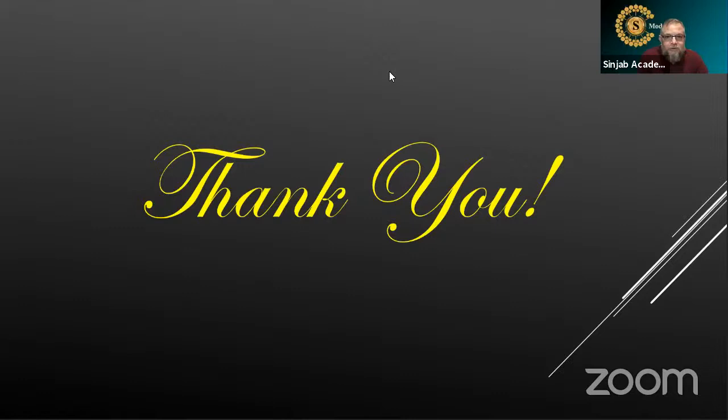Thank you very much, Dr. Gdih. Actually, that's wonderful. This is the first time I understand interpretation of visual field. Believe me, this is the first time. I was thinking that the only beautiful thing in the eye is interpretation of tomography, because it is full of colors, and the visual field is just black and white.